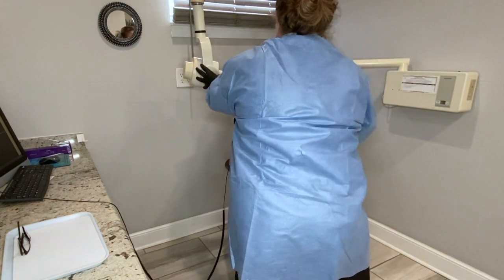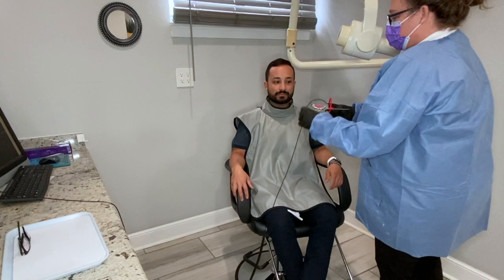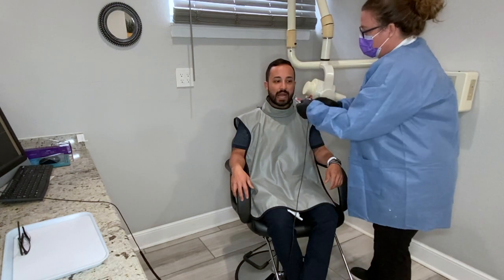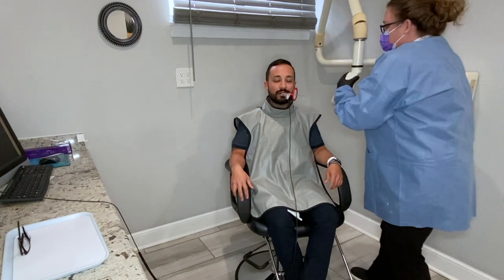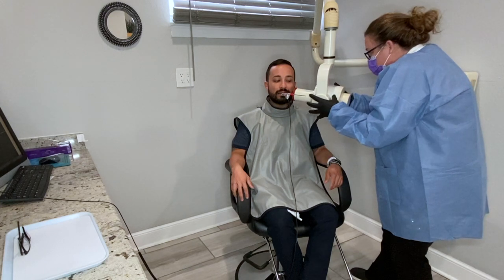Walk slowly out. Now instead of changing anything, I'm just going to flip our x-ray sensor over. We're going to do our premolars first on this side, slightly angled. Open for me and gently bite. Make sure we have the distal of that canine for the premolar shot. Make sure we're angled — nice and easy, nice and parallel.